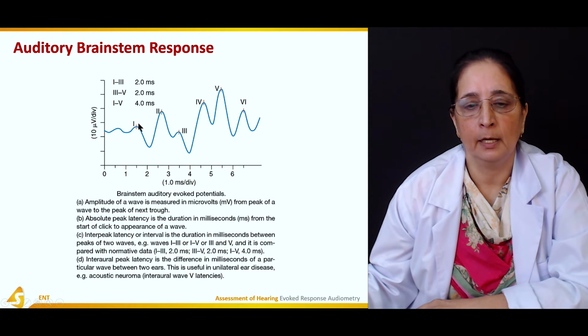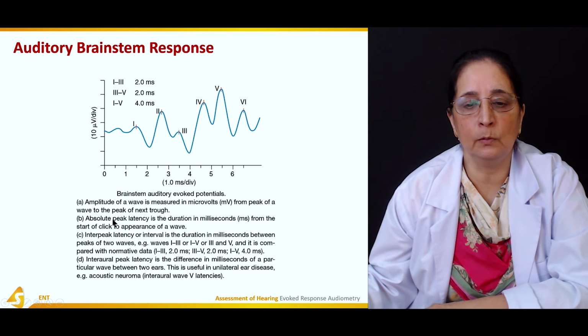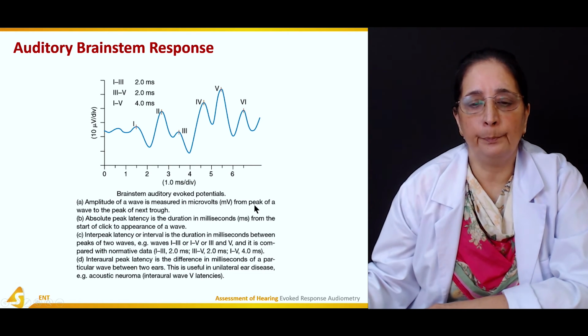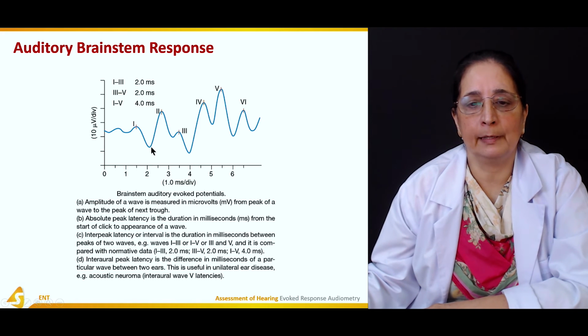Then what's the absolute peak latency? Absolute peak latency is the duration in milliseconds from the start of a click to the appearance of the peak of a wave.